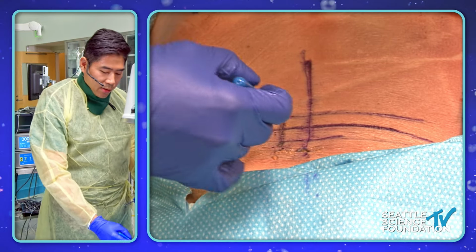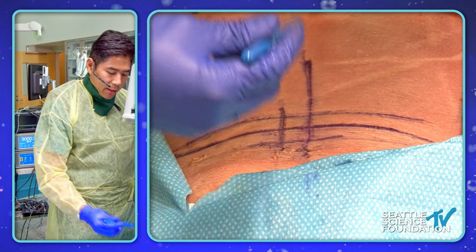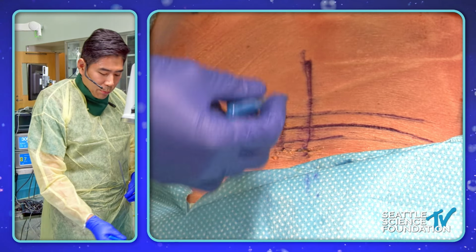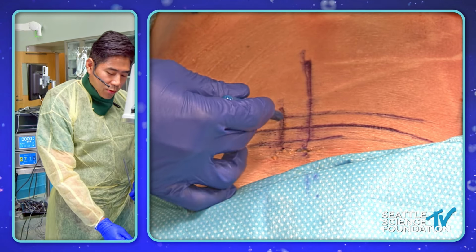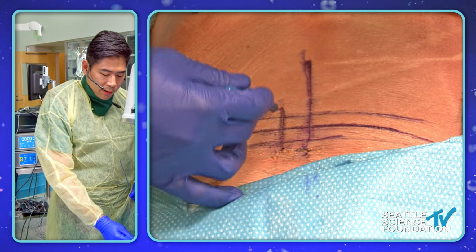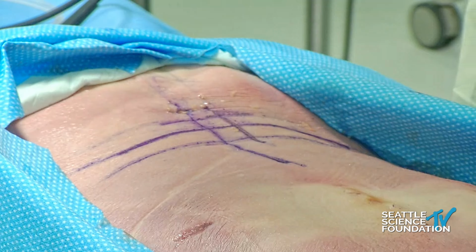Yeah, so exactly, according to the patient's body habitus and where the pathology is, the entry point can be varied. So let's say if you're trying to do a more caudally displaced disc, then you can move your incision a little bit more caudal.